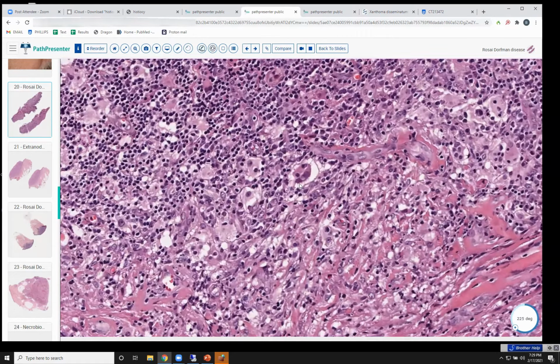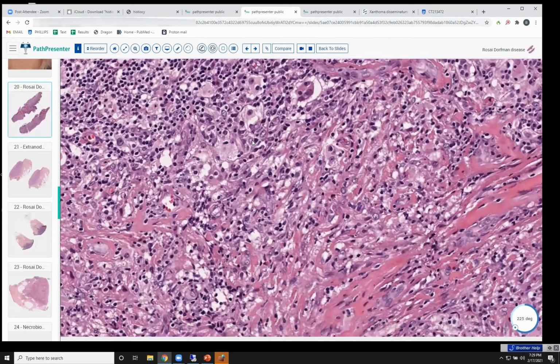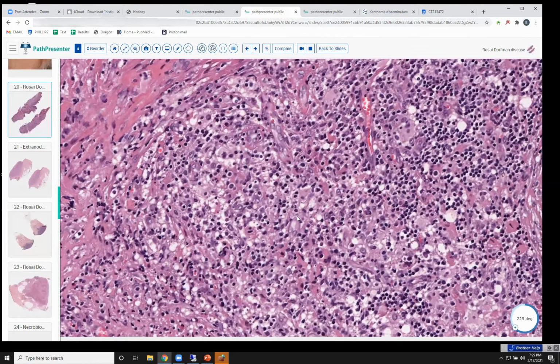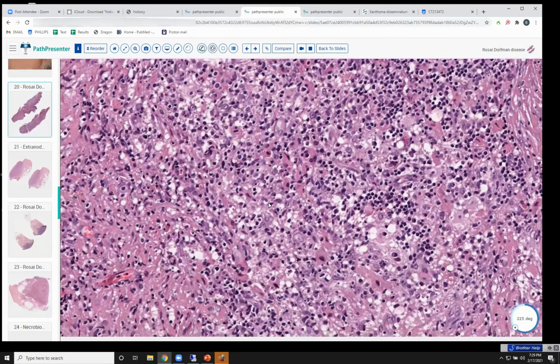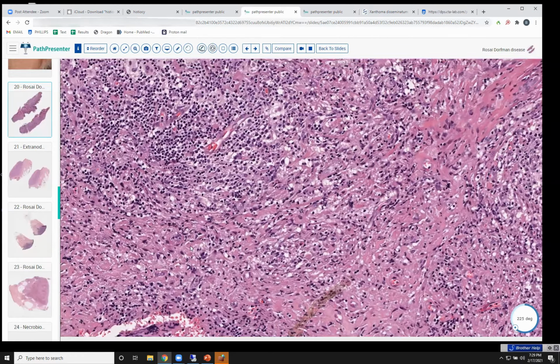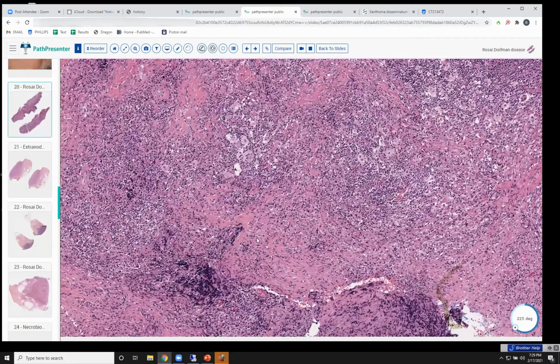And you also have giant cells, foamy giant cells. And if you look carefully inside these histiocytes, there's a lymphocyte inside the histiocyte. And I'll show you better examples of these. But these little blue cells inside the cells with the pink cytoplasm are the lymphocytes which have been engulfed, emperipolesis. So the other histiocytoses we've shown up till now have not had these kind of two-tone look.